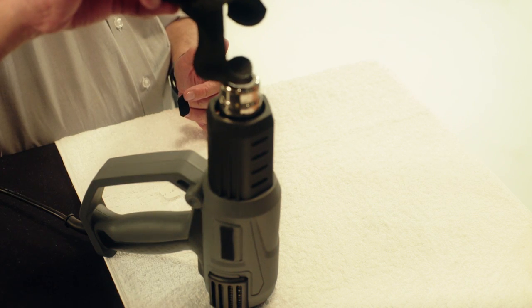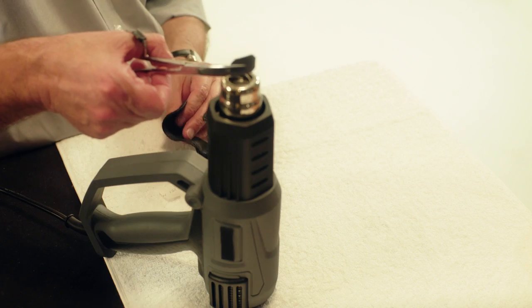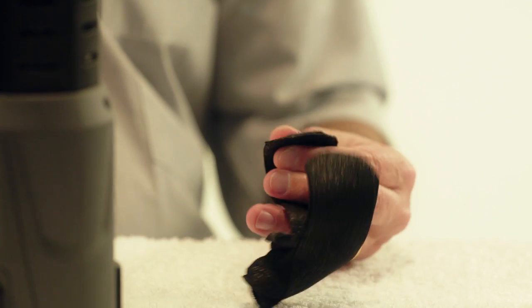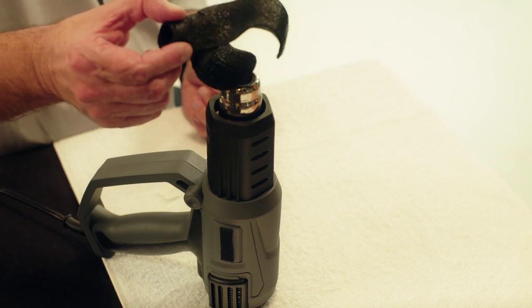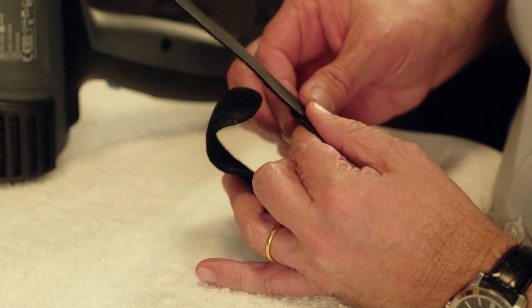Attach the self-adhesive Velcro hook by heating both the orthosis and the self-adhesive side of the tape with the heat gun and firmly stick them together. Attach the Velcro loop by heating the orthosis on the opposite side and press the fuzzy side of the Velcro loop into the thermoplastic material.